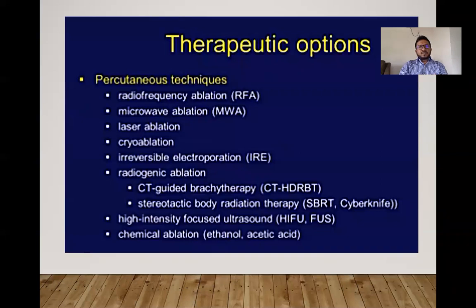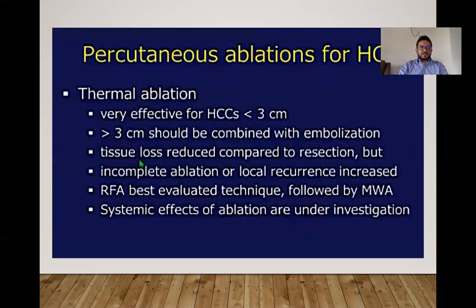Among the therapeutic options for tumor ablation, there are many techniques available at the moment. Most frequently used is radiofrequency ablation, which is the earliest modality we had. Then there is microwave ablation, laser, cryoablation, IRE or irreversible electroporation, high-intensity focused ultrasound (HIFU), and chemical ablation. Most are available except for a few, such as IRE and HIFU, which are not available in Sri Lanka, but the rest of the treatment modalities are available to us these days.